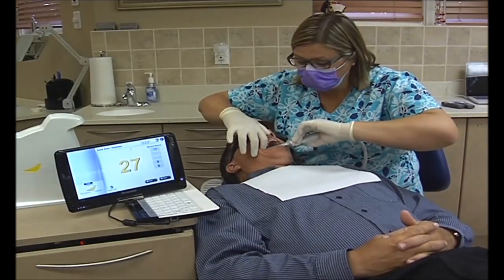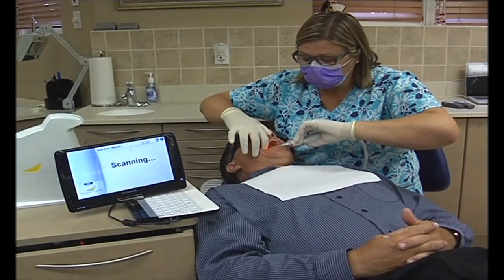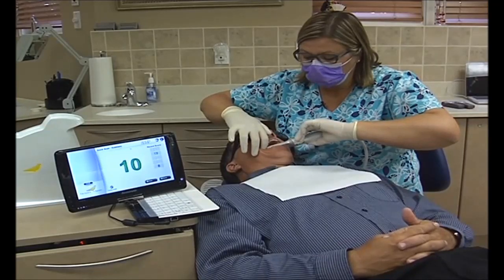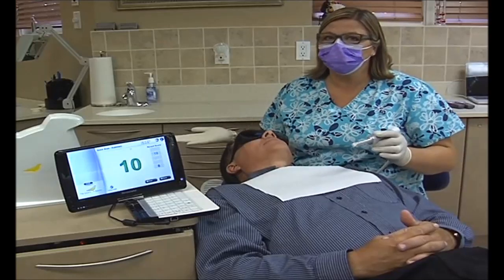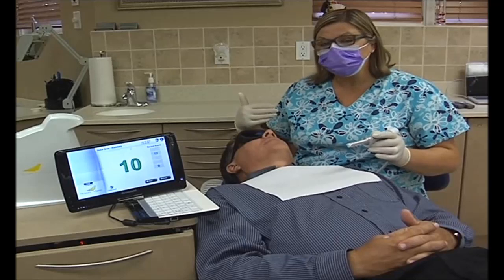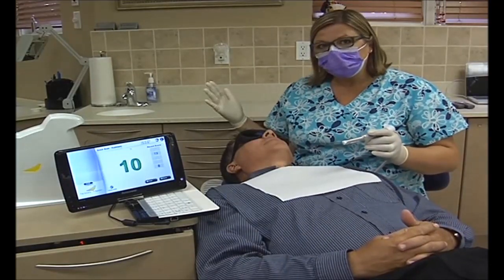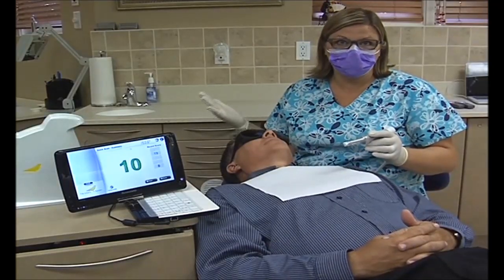So there you can see there's something going on. That was the distal lingual cusp. For this tooth, on the distal lingual cusp, we're getting a 27. This is something that I would note in this chart. I don't think that tooth needs to be replaced at this point, and I'm sure the doctor will concur that we will just keep an eye on it. We know we have a 27, so we're getting a little higher, but we can check that in six months at his next recall to see if there is any change in that number.